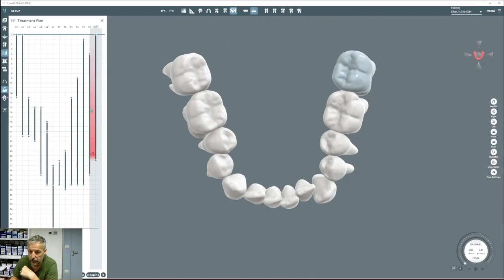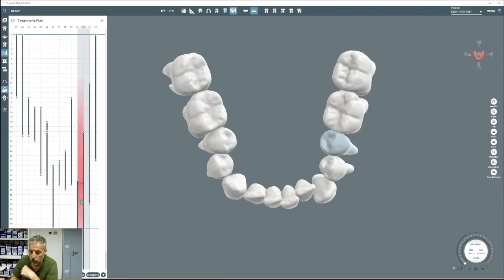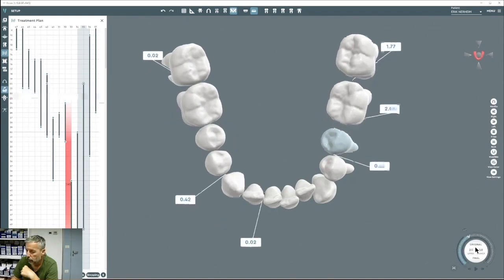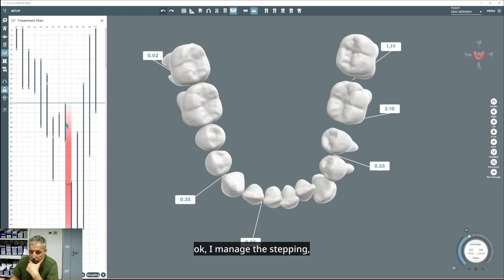I like to put like... okay, I manage the stepping.